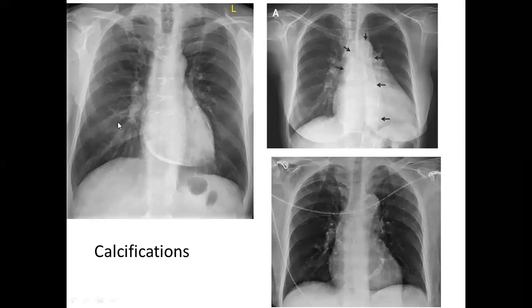So this patient underwent some transthoracic operation, and this calcification may be due to pericarditis. Well, maybe right here we are seeing some slight calcification, or maybe he had open heart surgery, and as a result we have a small amount of blood which is then calcified.